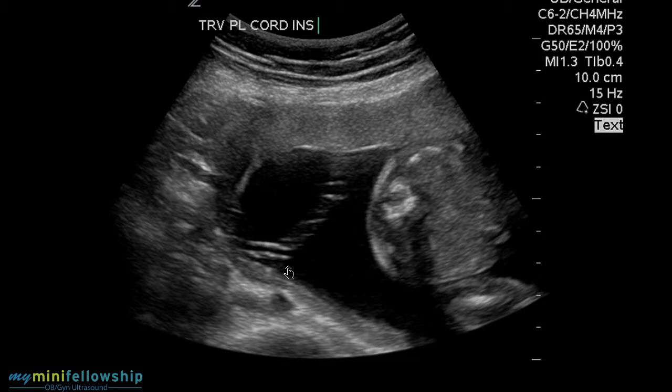And whether it has significance in terms of obstetrical complications of growth and premature delivery and things like that, I think is relatively less important to us as sonographers as its importance in terms of possible vasoprevia. There are times when you absolutely must check for a vasoprevia. Things that you thought were placenta previa that seem to have disappeared.